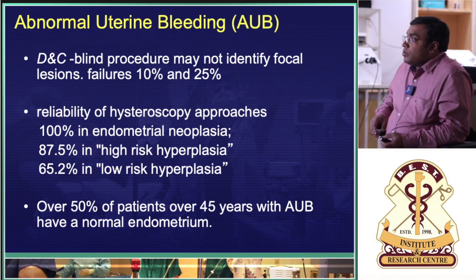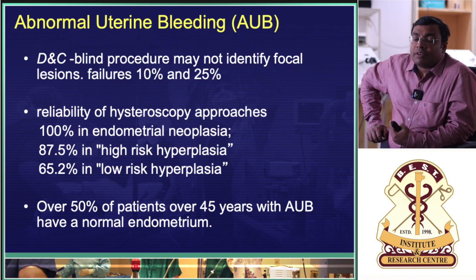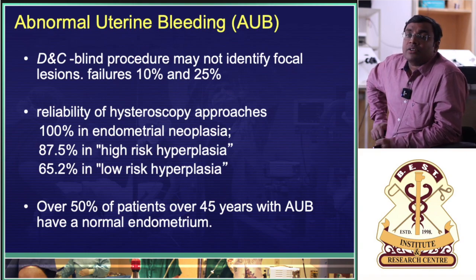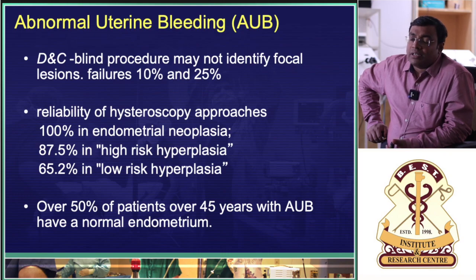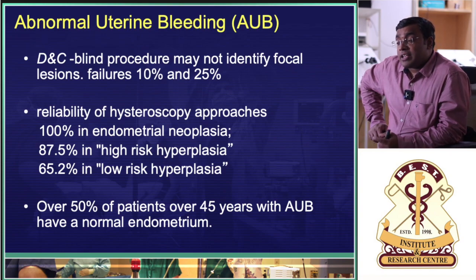So one of my first cases when I was doing my fellowship itself, when I was having few patients of my own, the first patient whom I did a hysteroscope was a lady who was referred to me for hysterectomy. She was a 35-year or 37-year-old lady who had menorrhagia. She had already undergone a D&C, and that didn't solve her problem. Then I did a scan, I felt there is a polyp. So I told her the treatment options. If you don't want any kid, she already had one kid.